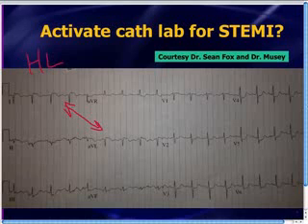When you get a 12-lead EKG, don't just jump to conclusions. Don't just jump right away to the most obvious diagnosis. I think it's important to always have a checklist or a method or a way that you interpret every single EKG. Some of you may have learned rate, rhythm, axis, intervals, hypertrophy, infarction, whatever it is, whatever book you learn from, whoever taught you, use the same method every single time. Don't just jump to the most obvious diagnosis, or you might, in some circumstances, miss something.